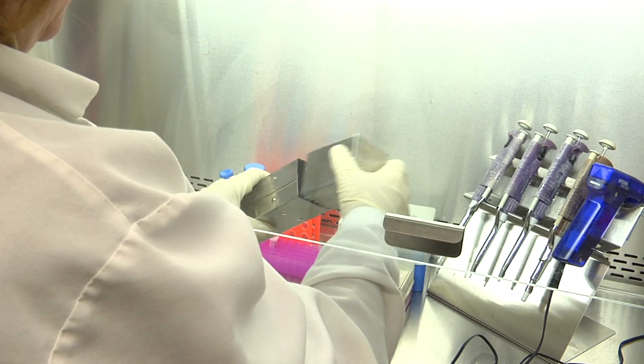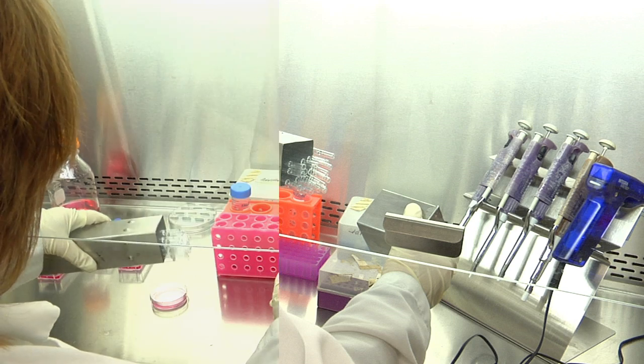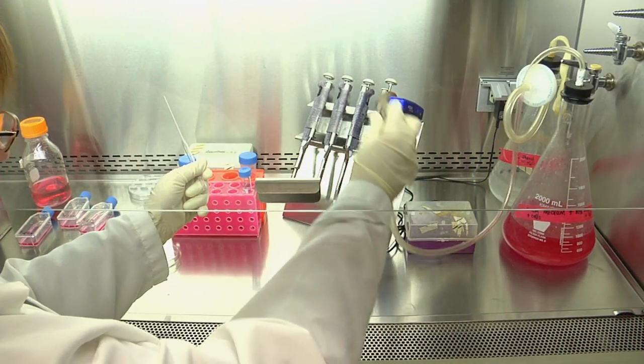To remove the Pasteur pipette, you should make sure that you do not touch anything outside of the container with the tip of the pipette. Pipettes can be gently moved out slightly by shaking the container, then pull quickly on one of the pipettes.